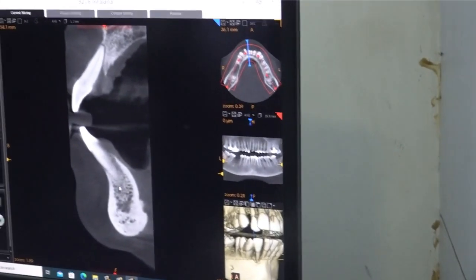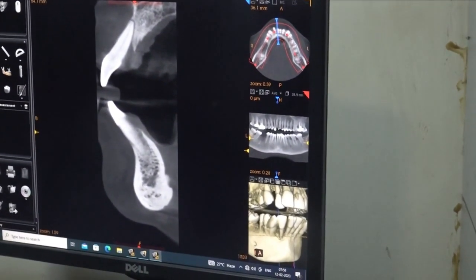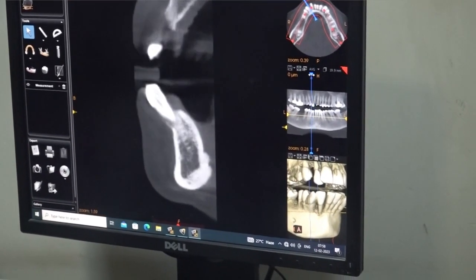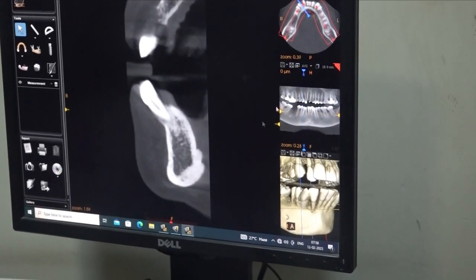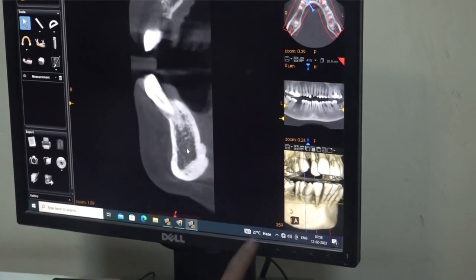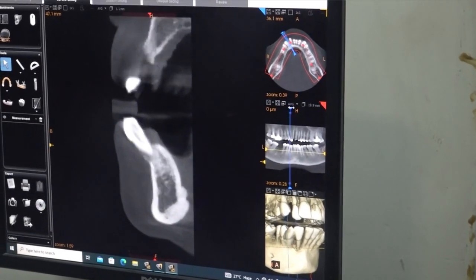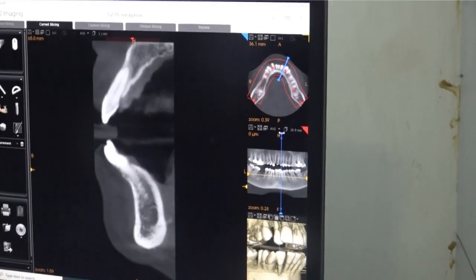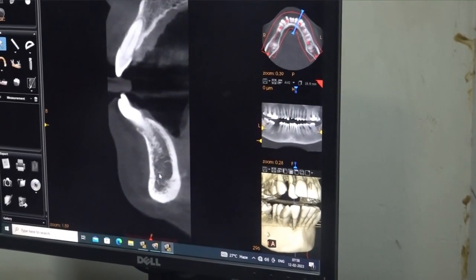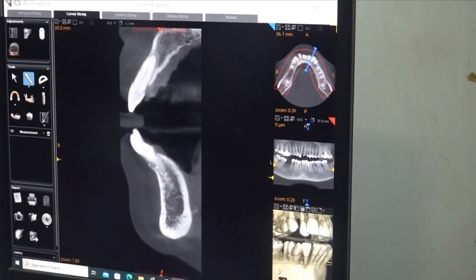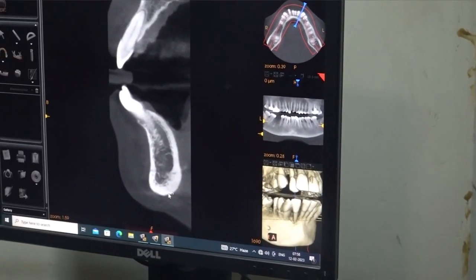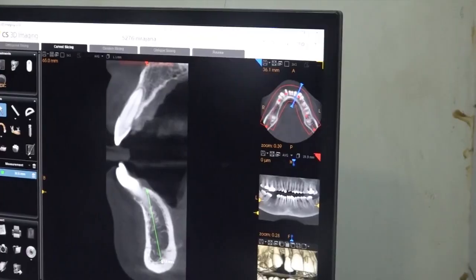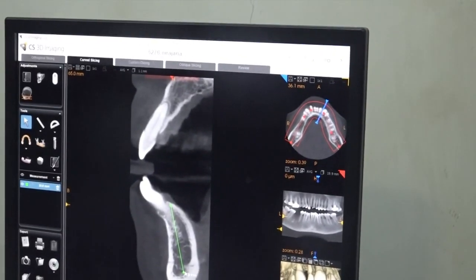Now we will look at the intramedullary bone just next to the midline. There are 4 or 5 types of shapes in lower anterior bone, as described in the literature. The intramedullary bone next to the midline is quite good, but in the canine region it is very porous. When the canine bone is porous, do not seek support from the lower border — keep the implant away from the second cortical, the anterior cortical border.